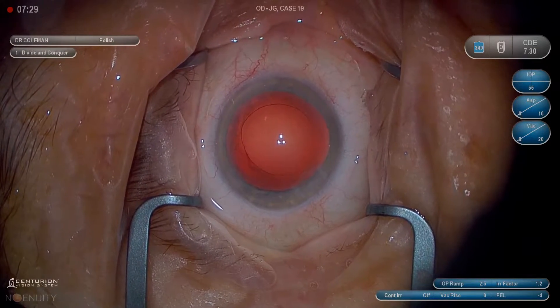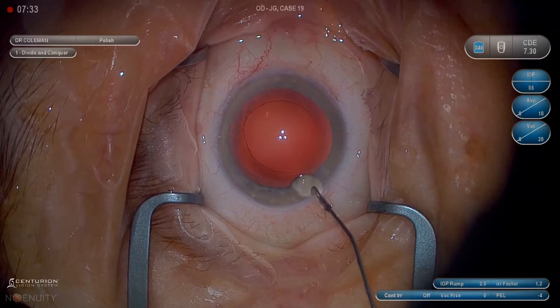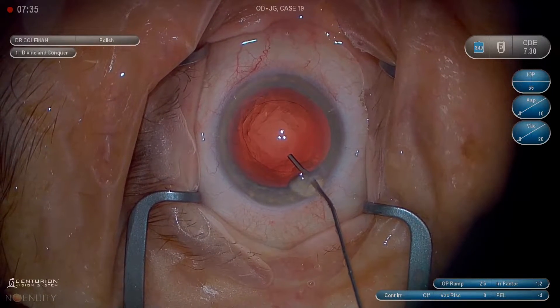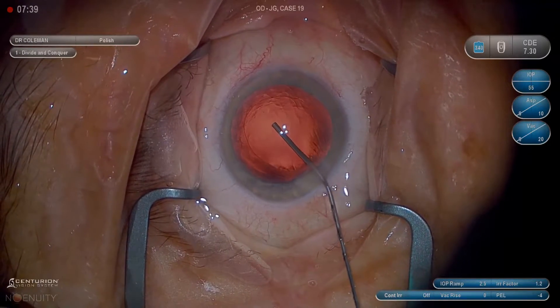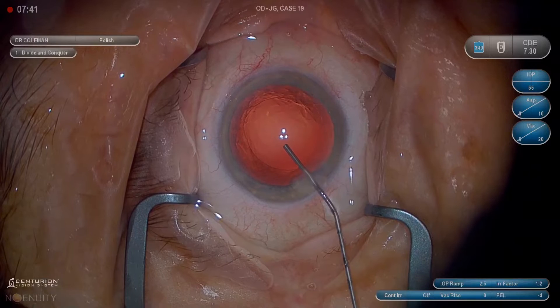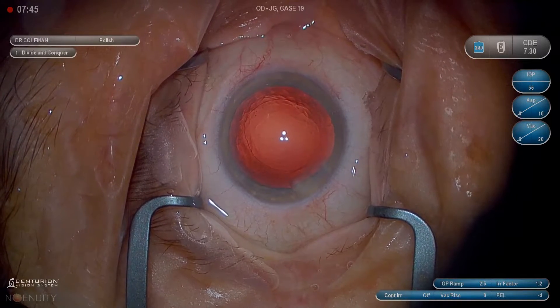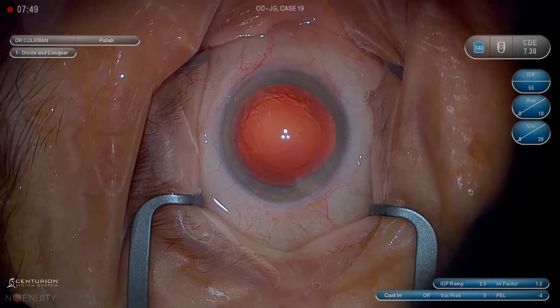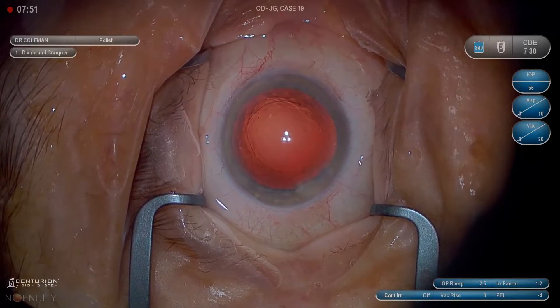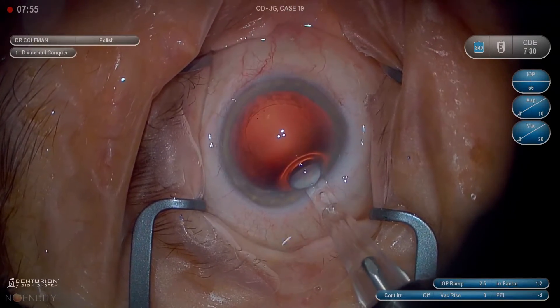When we're injecting ProVisc or our cohesive viscoelastic, we want to fill the bag first. Remember, you can't hit the posterior capsule with the cannula as long as viscoelastic is actively being injected into the eye — it creates a fluid wave that protects the capsule. So we fill the bag first and then the anterior chamber. If we fill the anterior chamber first, we risk pushing the posterior capsule back and not getting a full capsular bag with space for the lens.